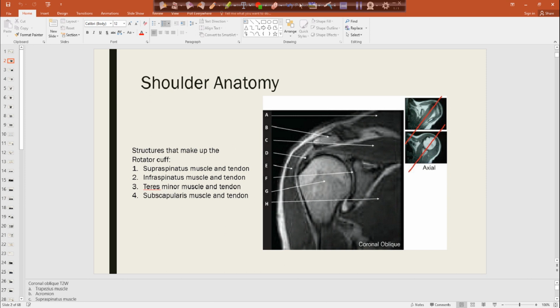So this is that supraspinatus muscle that you're aligning your slices with. Turns into the supraspinatus tendon. Then D, they just say rotator cuff where they all converge. E is your deltoid muscle. Deltoid, your most peripheral muscle on your shoulder.